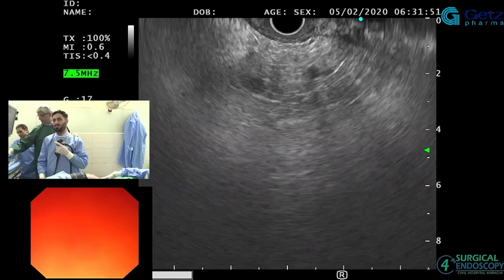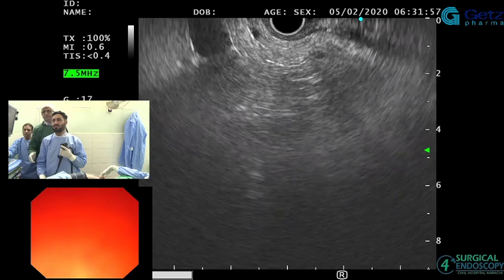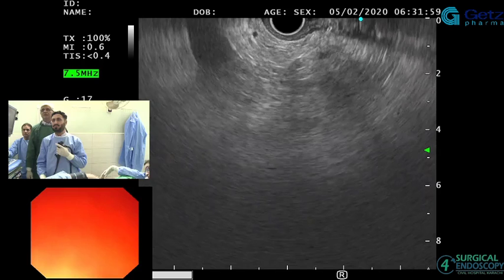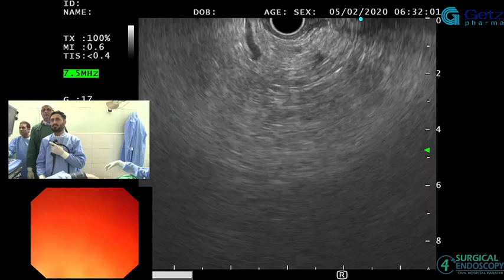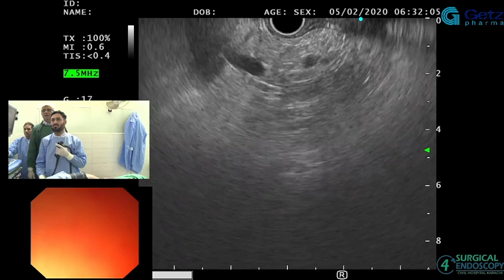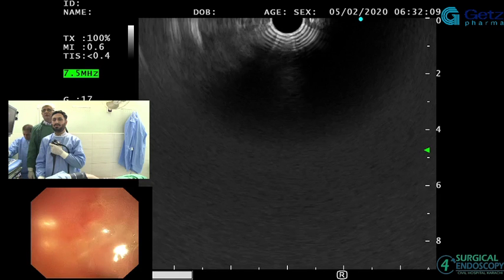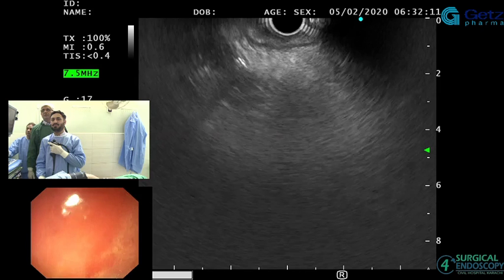So we go back. Now, you need to bring the CBD because I want to see what's happening here. Have you fallen back into the stomach? I have a feeling you might have. Yeah. Okay, tip up, please.